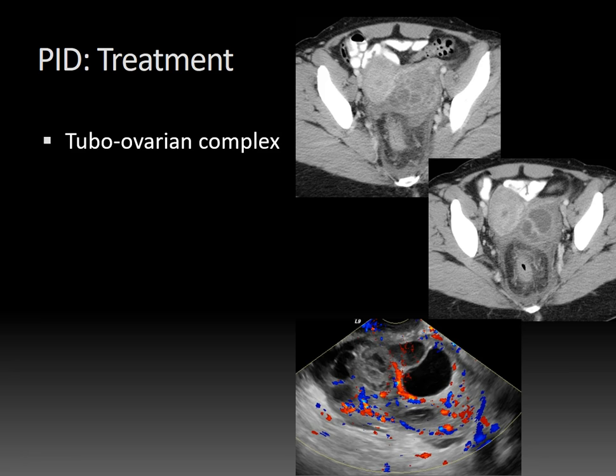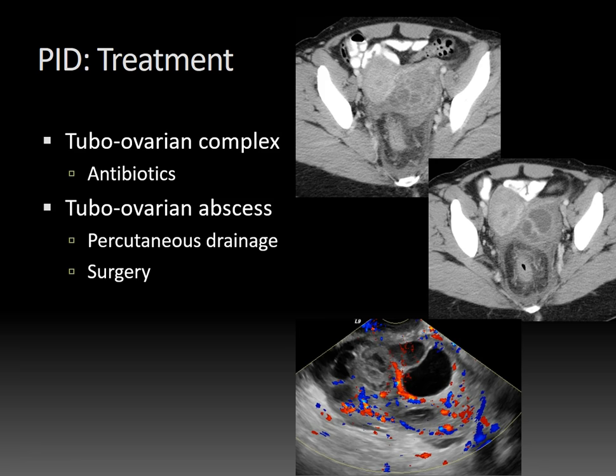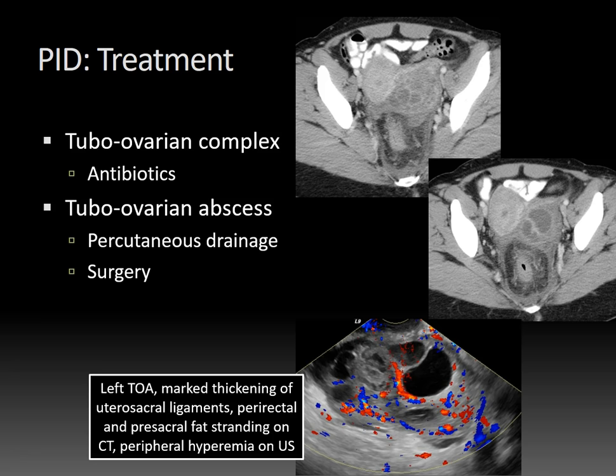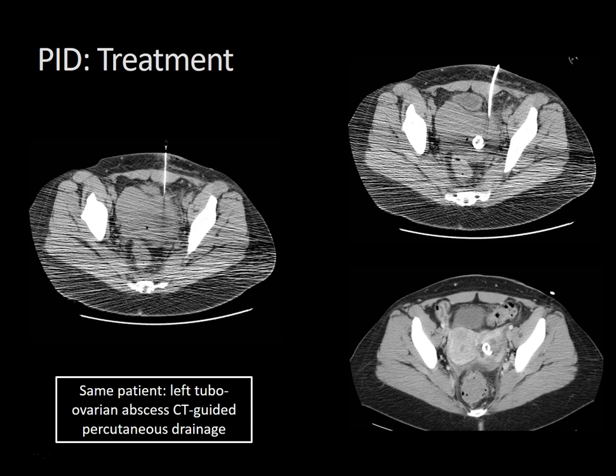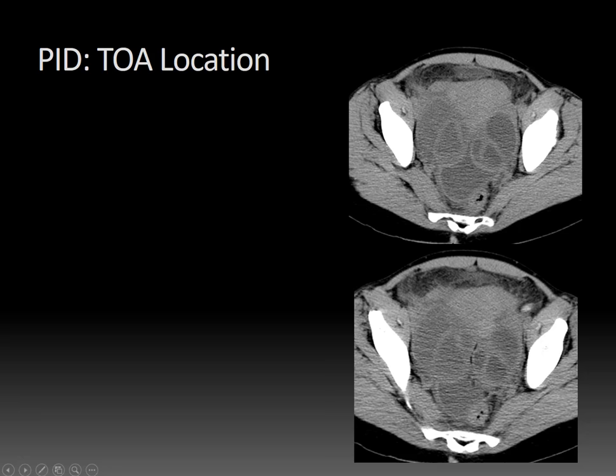Why differentiate between these two? It's important for treatment. If you have a tubovarian complex — salpingo-oophoritis — that's typically treated with antibiotics. However, once an abscess forms, that usually needs to go to drainage or surgery. Here you can see a patient with a large multi-loculated left tubovarian abscess with no normal ovarian architecture, marked thickening of the uterosacral ligaments, perirectal and pre-sacral fat stranding on CT, and extensive peripheral hyperemia on color Doppler ultrasound. This patient went on to have CT-guided percutaneous drainage of that left tubovarian abscess.